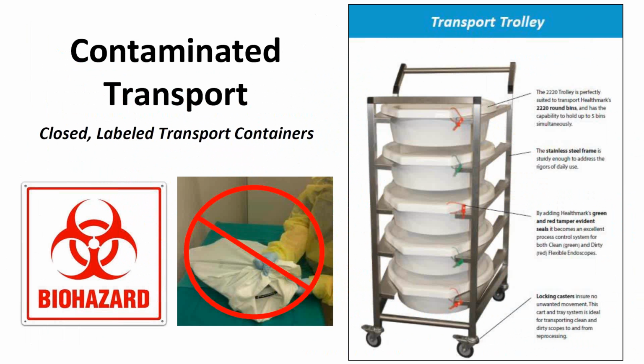After we've performed pre-cleaning and utilized all of the recommended adapters that the endoscope manufacturer has provided with the endoscope, the scope is now ready to transport to reprocessing. And this could be done in many different areas in your facility. It could be in GI reprocessing, it could be in the bronch lab, could be in central sterile. So it's very dependent on how your facility is set up. But we now need to take that endoscope from the patient room to wherever reprocessing is being performed.